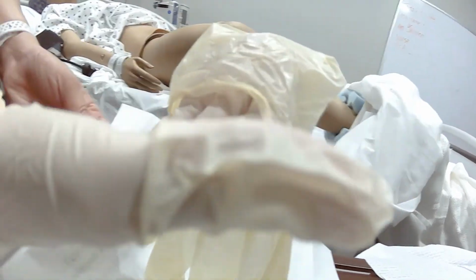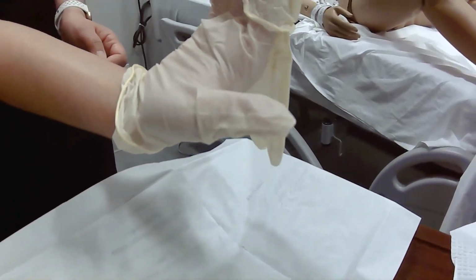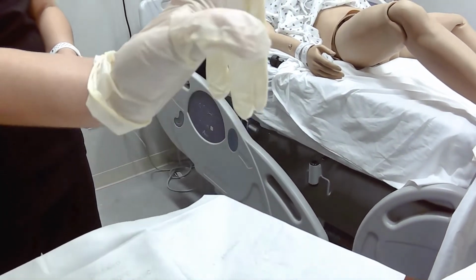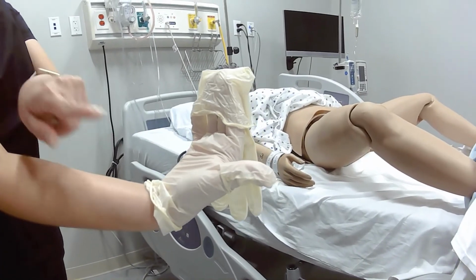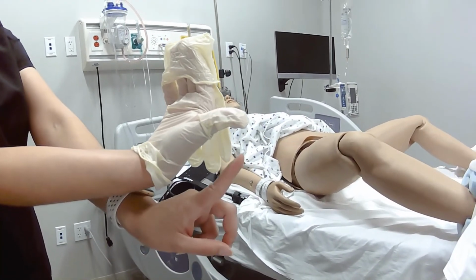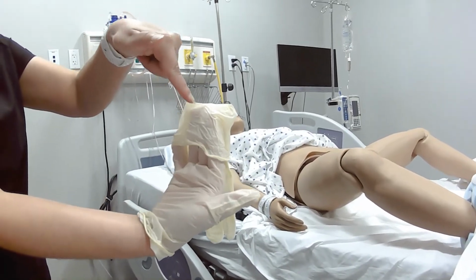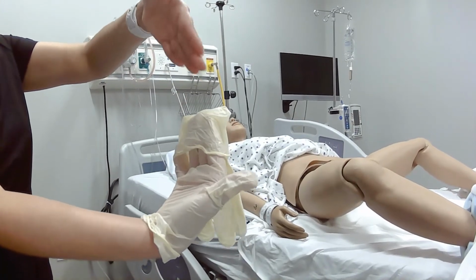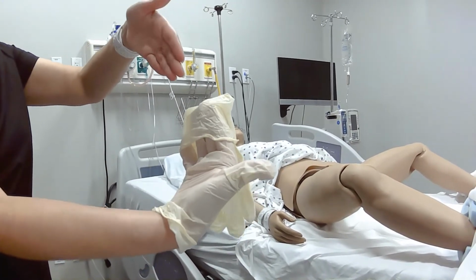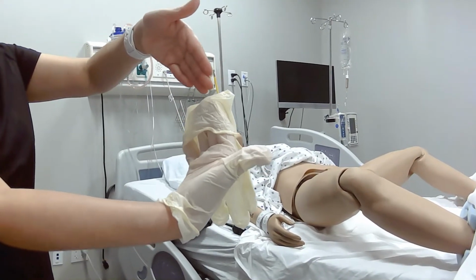So I'm picking it up using my 4 fingers that are sterile, so I'm touching it sterile to sterile. Notice how my glove is sticking out. I don't want to contaminate my sterile thumb with a non-sterile glove, or when I'm sliding my other hand in, I don't want to contaminate. So I always like to stick that out like I'm hitchhiking so it doesn't get me in trouble.